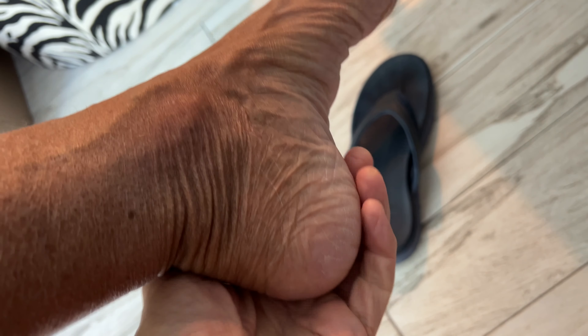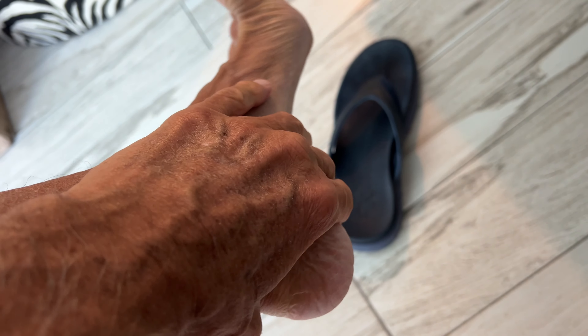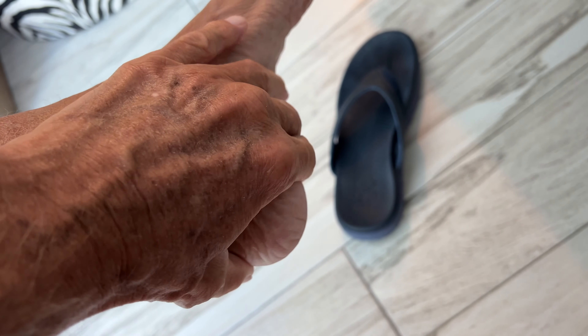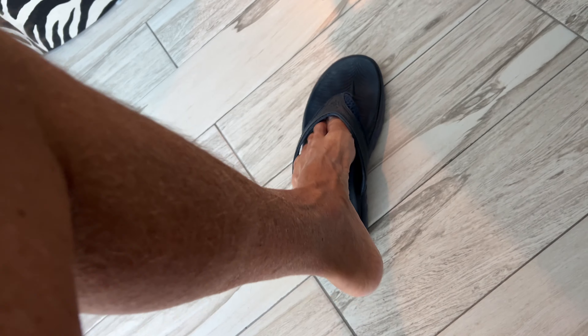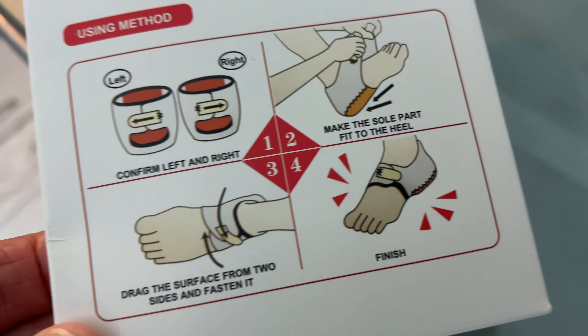My heel has been killing me and I think I've got plantar fasciitis or a bone spur or something. So I purchased these and I'm going to try them out.